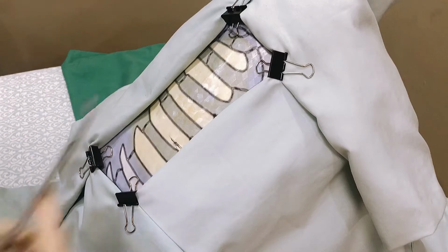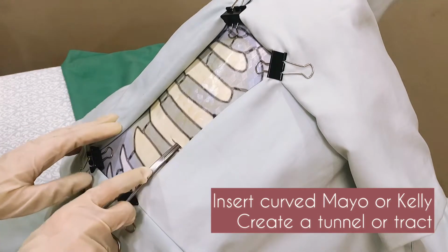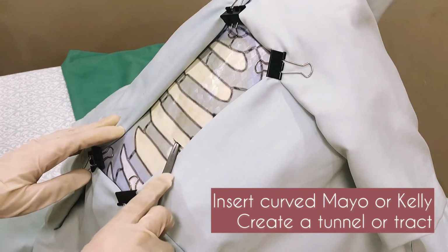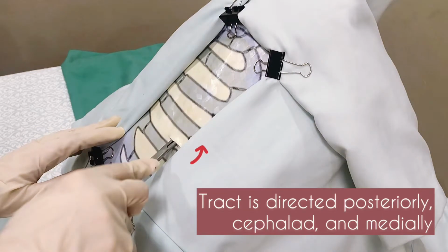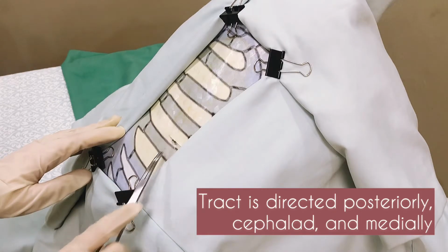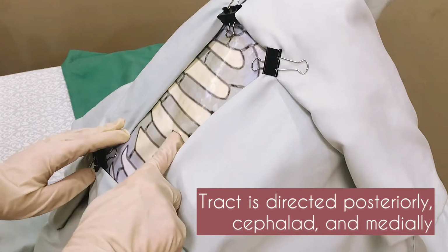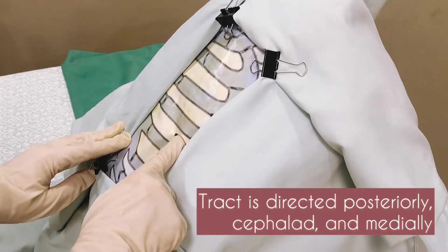Insert a curved Mayo scissors or curved Kelly clamp and cut or separate the tissues so as to create a tunnel or tract in the direction in which the tube is to be inserted. This tract should be directed posteriorly, cephalad, and medially so that the tube lies posteriorly in the paravertebral gutter. Continue developing this tract all the way into the pleura.